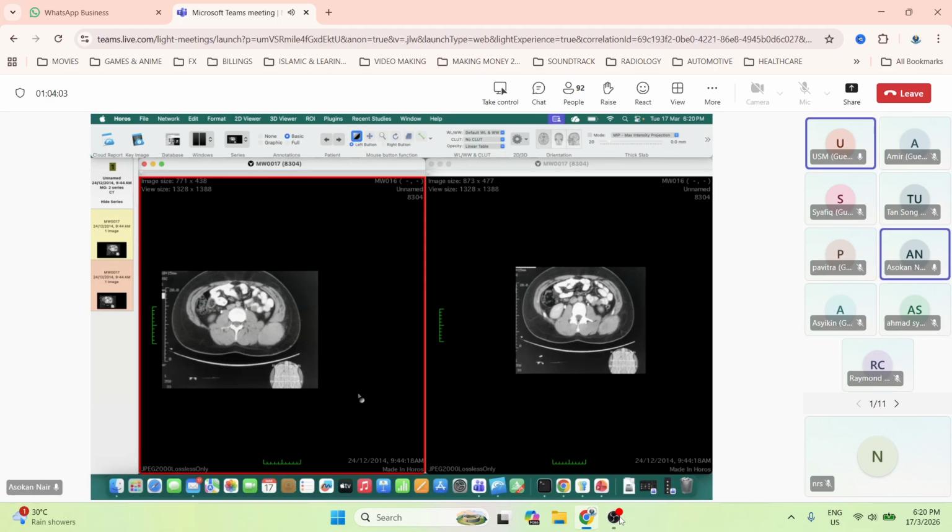Okay, fine. So this is in the abdominal wall, right? Yeah. Okay, fine. What if I told you this patient has had repeated endoscopies for multiple polyps? So what do you think of? Peutz-Jeghers syndrome?